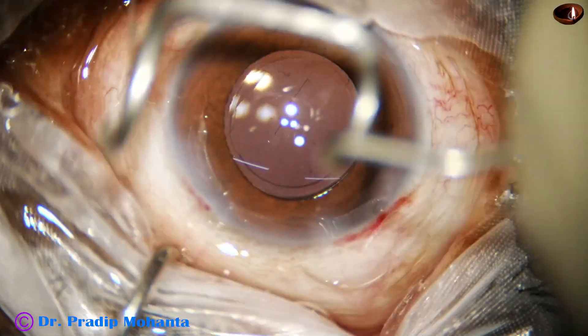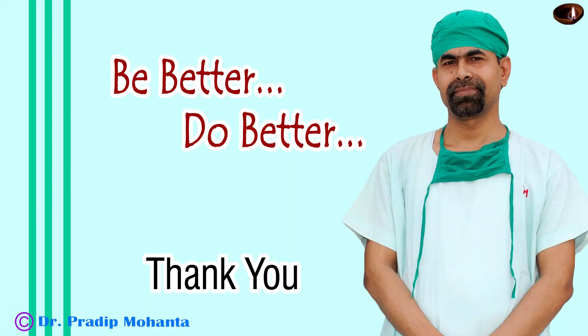Thank you very much for your attention. Hope this video will help you in developing your surgical skills and encourage you to learn the pre-chop technique.